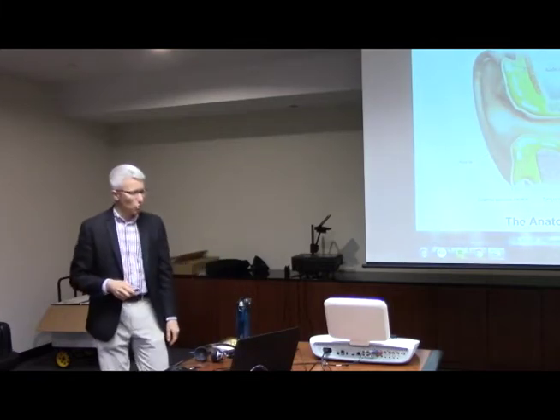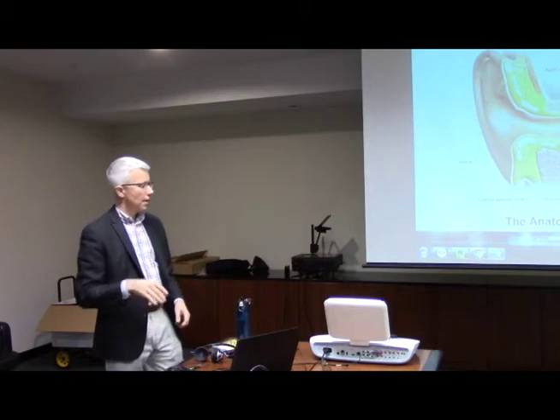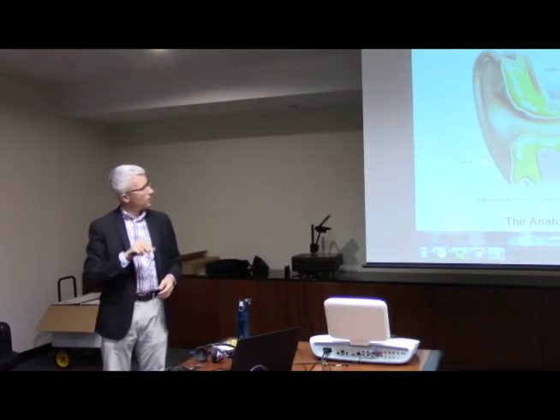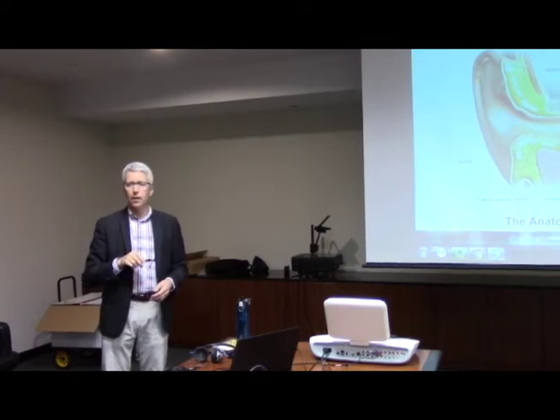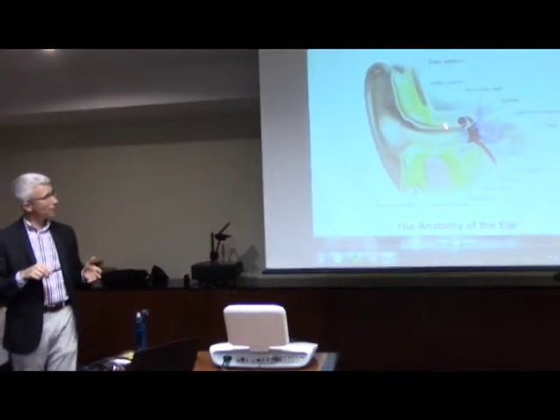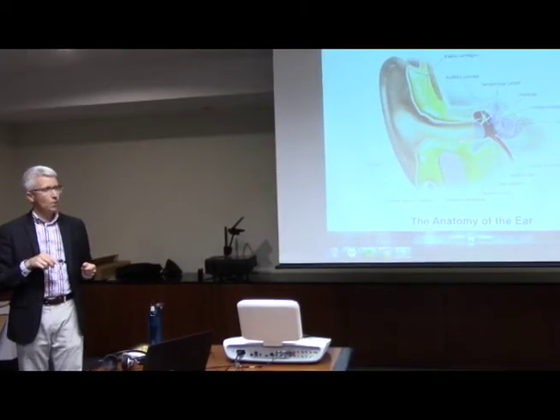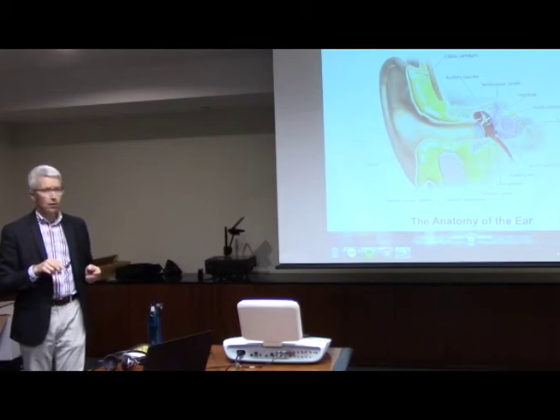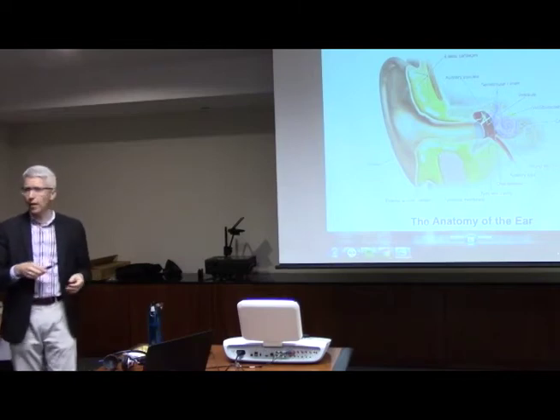Okay, so I mentioned headphones or earphones. Headphones, insert earphones, and pure tones, and then words. Well, if I do a hearing test and the sound's having to go through here, into here, and up, if there is a problem, if there's a hearing loss, I don't necessarily know where the problem is. I probably know it's not here because I would have looked in the ear first and made sure that was clear. But if there's a problem here, or if there's a problem here, I'm not going to know which one because the sound's having to go through the whole thing.